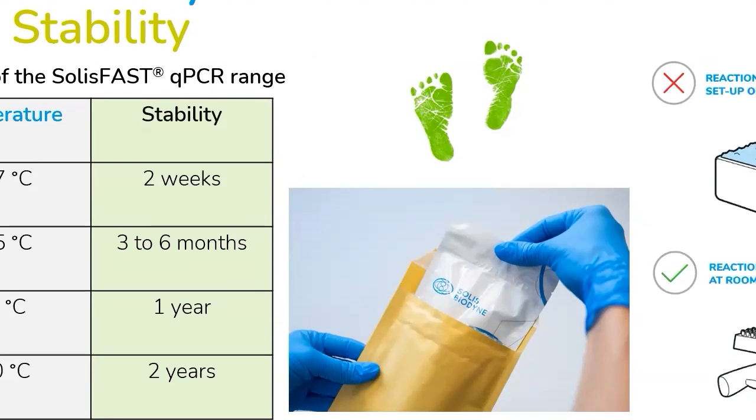And also, if the testing has been given to the hands of different professionals in different settings, then the ability of being able to set up the reactions without any ice can also be very beneficial.